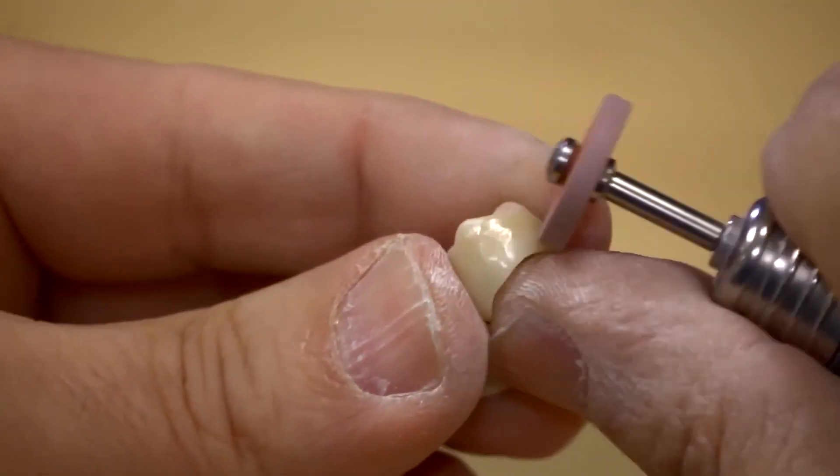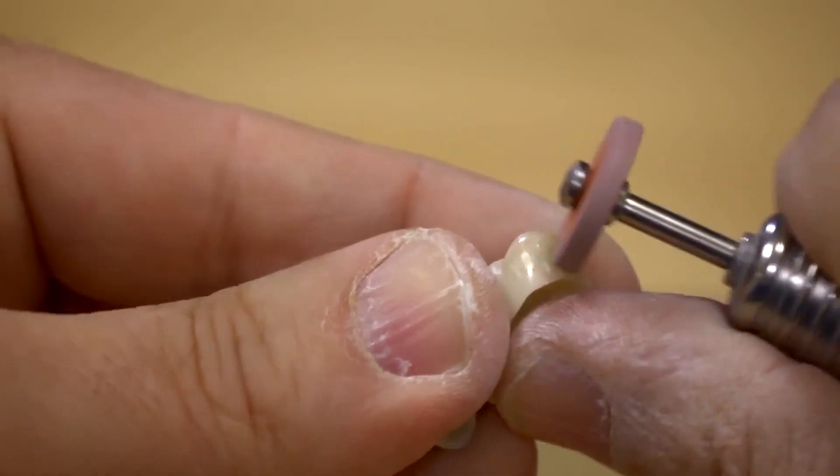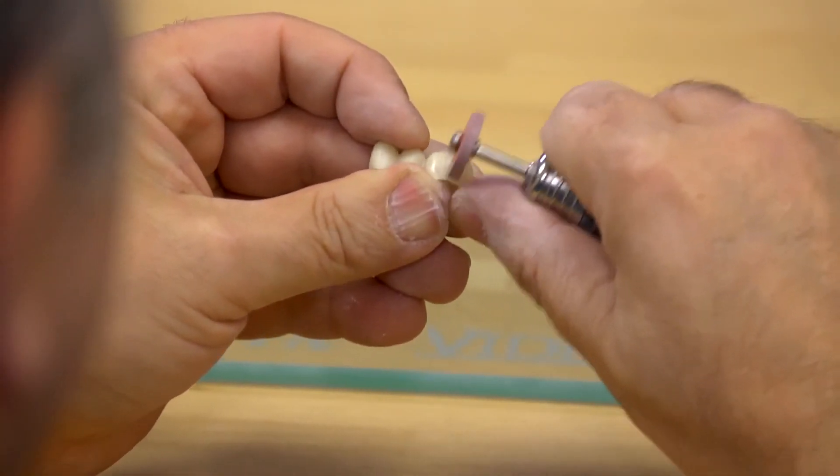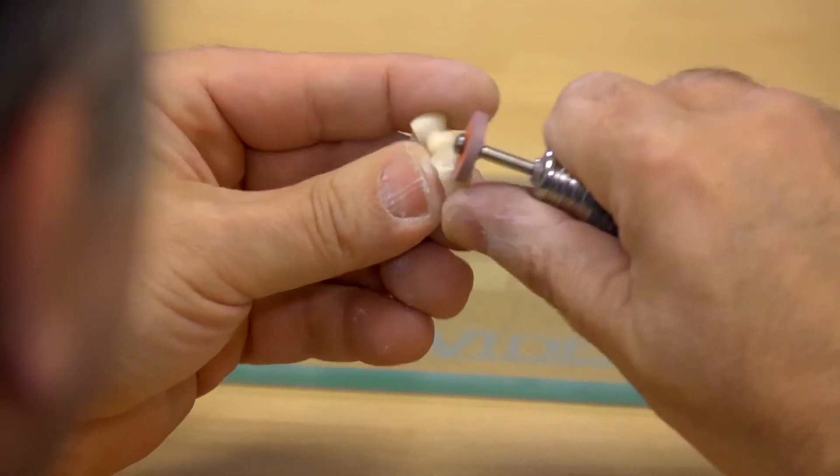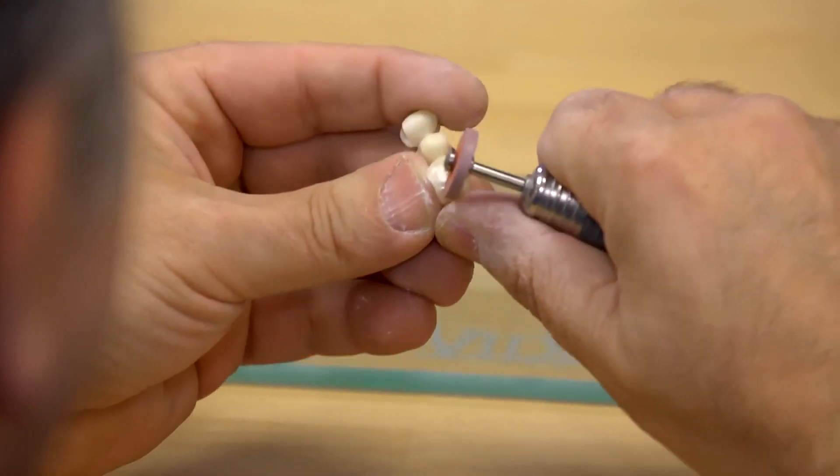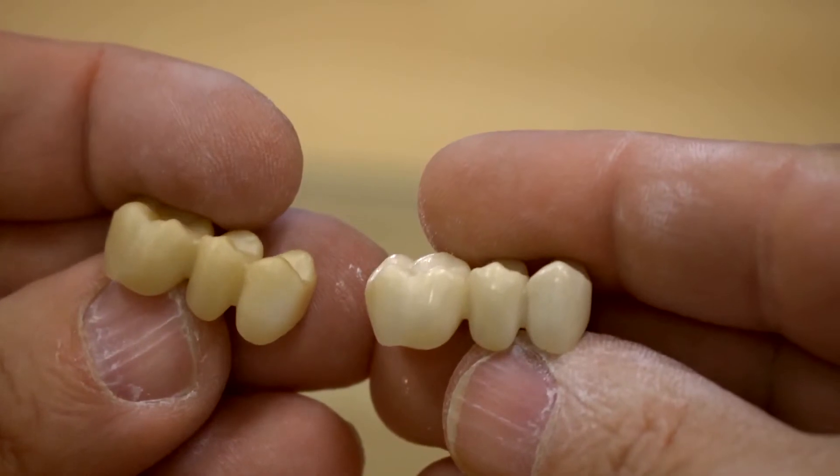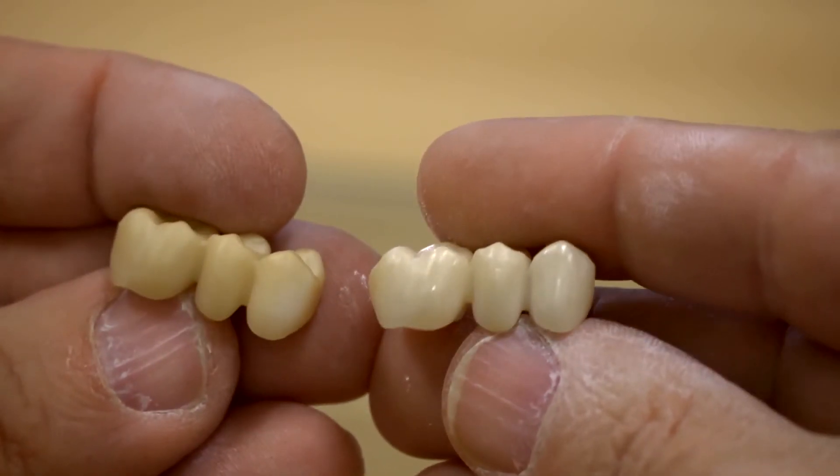The sintered restoration should also be polished prior to applying enamel coating in order to prevent abrasion to the antagonist following potential loss of shine. Inchorus TZI can be polished with all standard polishing agents for zirconia ceramics. Here's how the crown should look after polishing.